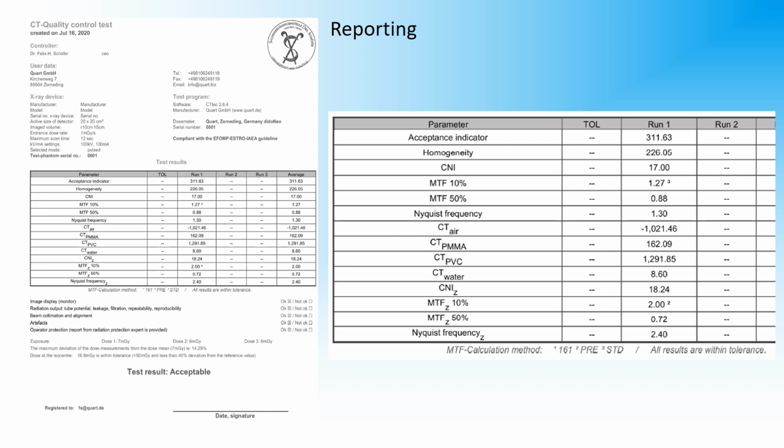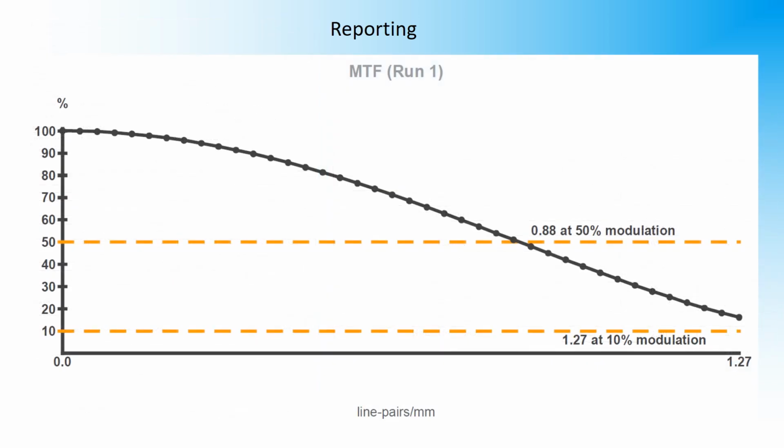On the back side it shows the MTFs of the system. Here you can see the 50% MTF and the 10% modulation transfer function. The latter one is not reached by the MTF graph, so it is set equal to the Nyquist frequency.